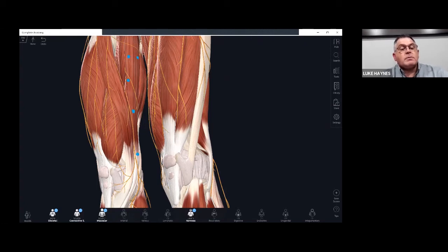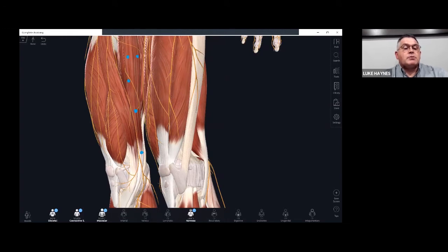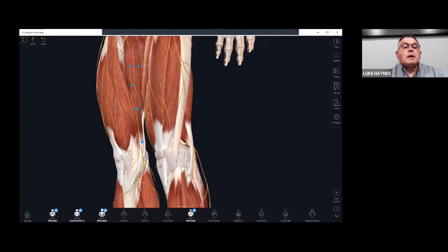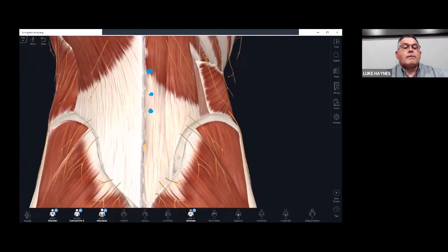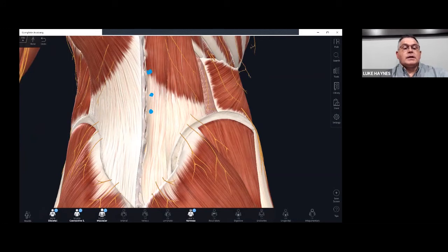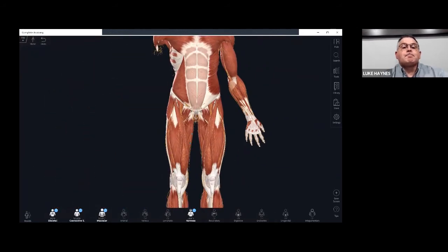So we'll drop a needle there, and then we're just going to split the difference between these two and drop a needle right in between. And so we've got the 3 adductors between sartorius, gracilis, and a needle there at the adductor tubercle, and then midway in between those 2 muscles. Again, we can also look at L2, L3, L4 for our proximal spinal location. That's where the obturator nerve originates, and that would give us a more proximal location to provide stimulation.